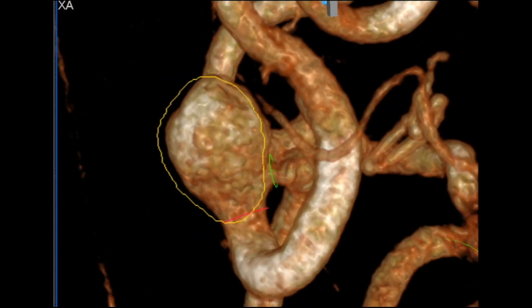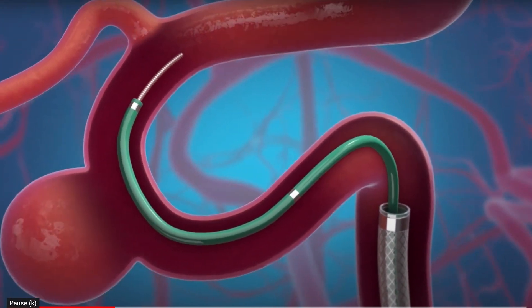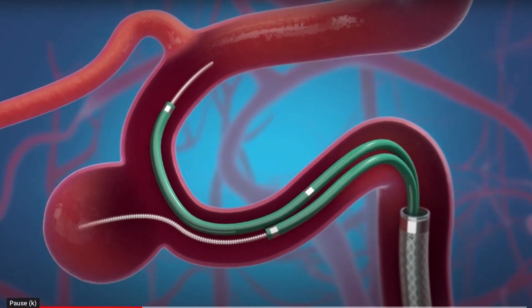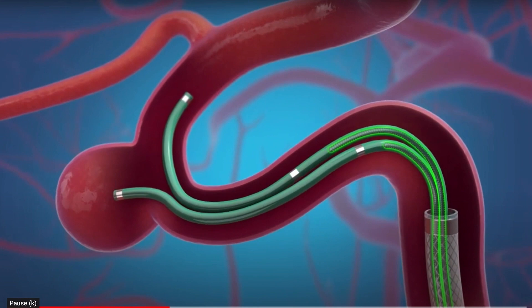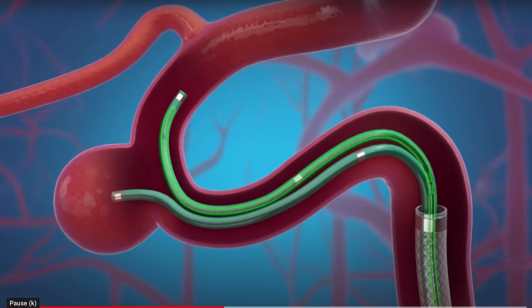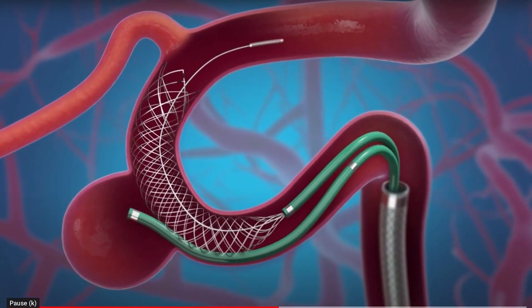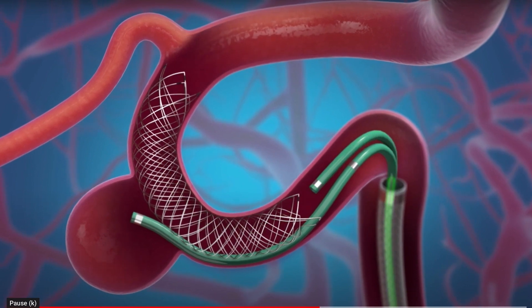One of the advantages of doing a cone beam CT even before you start is that it lets you lay out the angles so you know exactly where the inflow and outflow vessels are. This is what the LVIS stent looks like. The typical technique is to place the stent first and then pack — which is not what we did. This modified approach is an alternate technique which can be utilized.